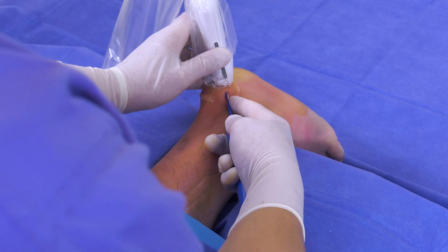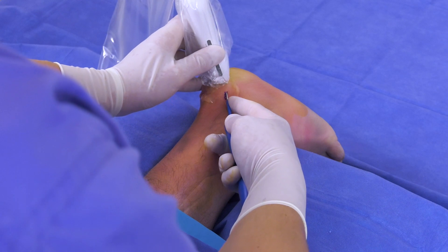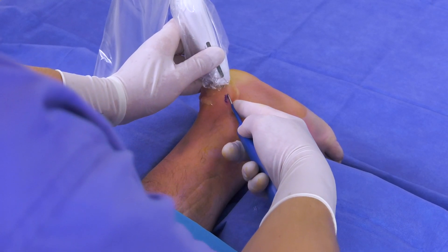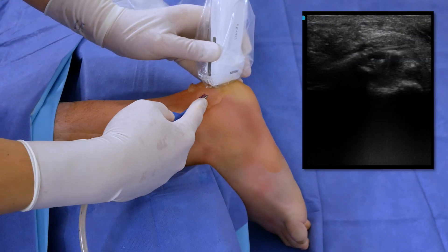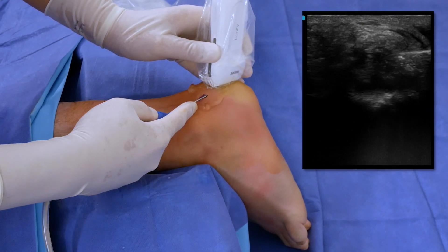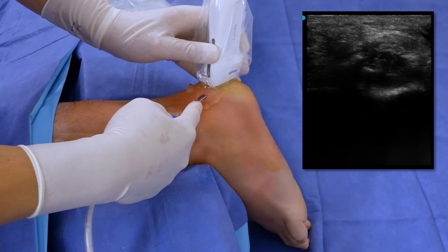As I maneuver the device in this axial plane there is a tactile component. Initially the diseased tissue creates some resistance, but as I continue to motion the device back and forth you can feel a decrease in the resistance. As you can see on ultrasound, we are seeing less hypoechoic or black tissue, which means that the diseased damaged tissue is being evacuated by the device.